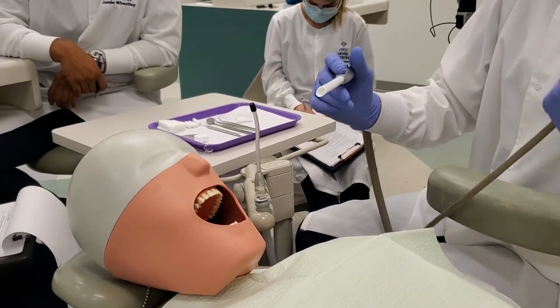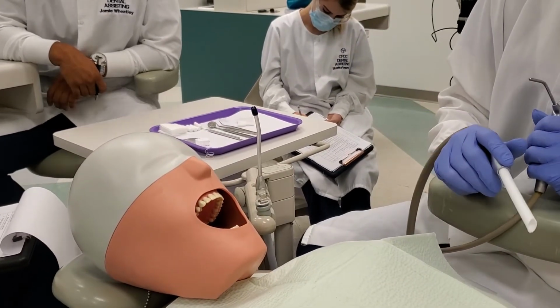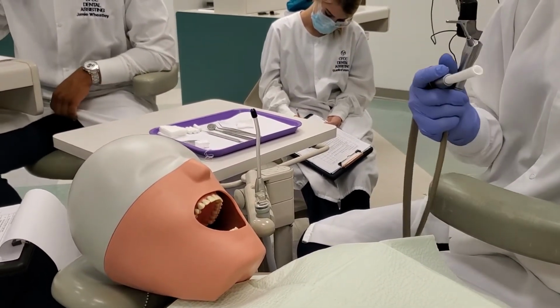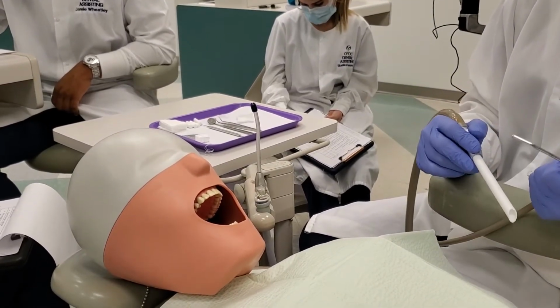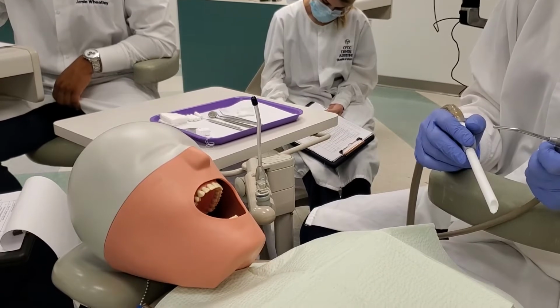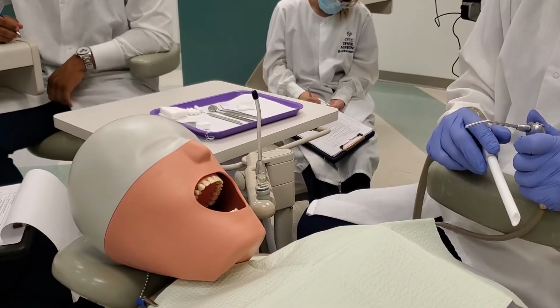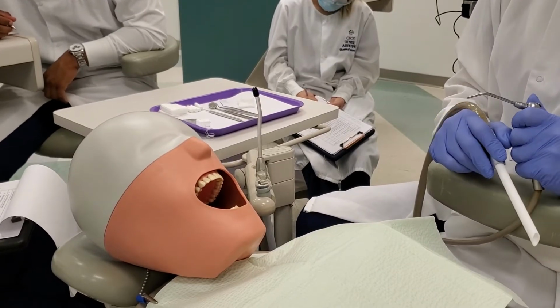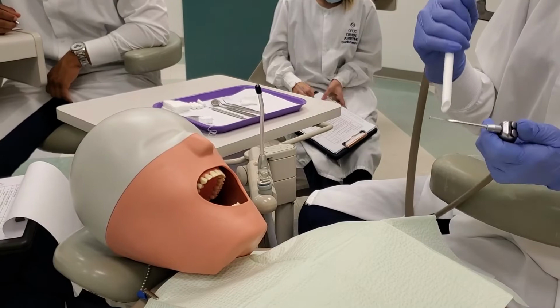You can do whatever you want to with it, okay? But you're just going to clear that line. So rinse and dry. So number 4, air water syringe. Rinse and dry a mandibular tooth using the water, the air and water together, and then the air. And then I'm going to have you rinse and dry a maxillary tooth, and then I'm going to have you clear the mouth mirror.